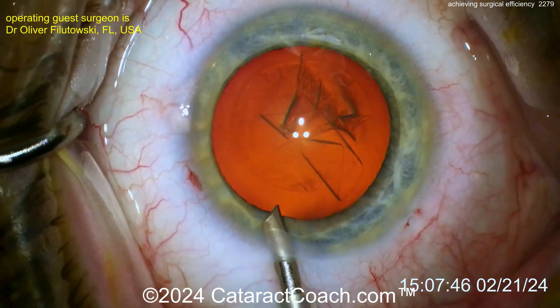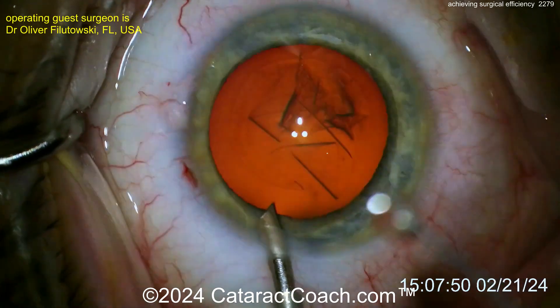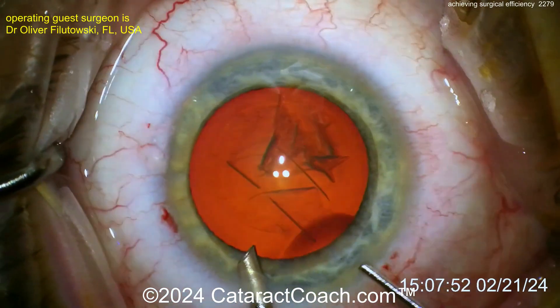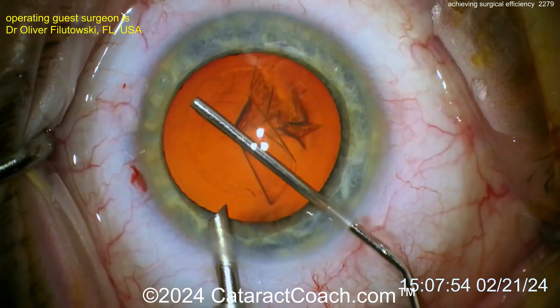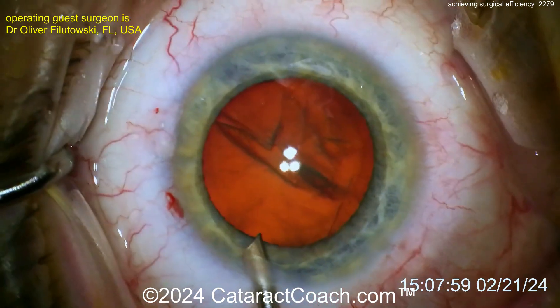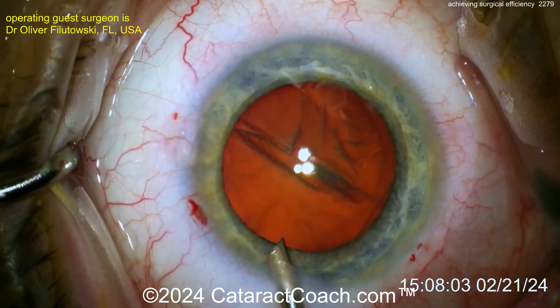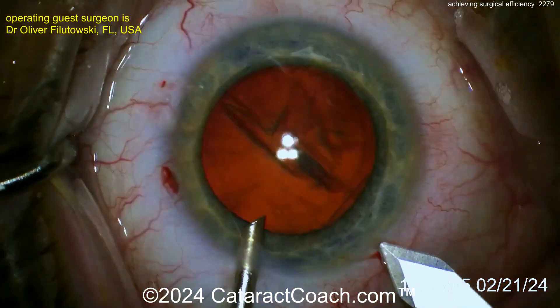Bent needles — all you need. The capsule that's been torn — that cap is going to be aspirated out with a phacoprobe. Probably a hydrodissection. Yeah, a little bit of hydrodissection. There's a good fluid wave. It kind of looked like it tented up the capsule a little bit there, so maybe cortical cleaving hydrodissection.